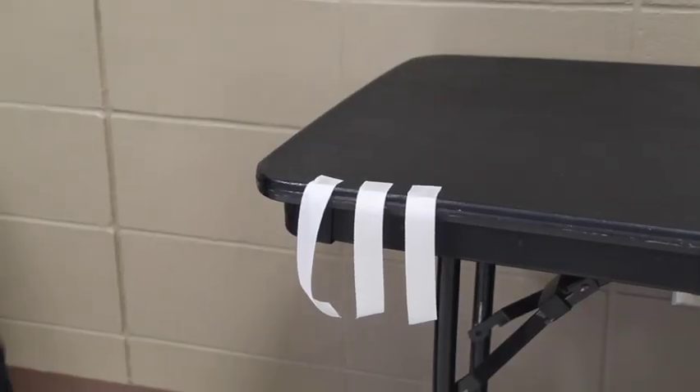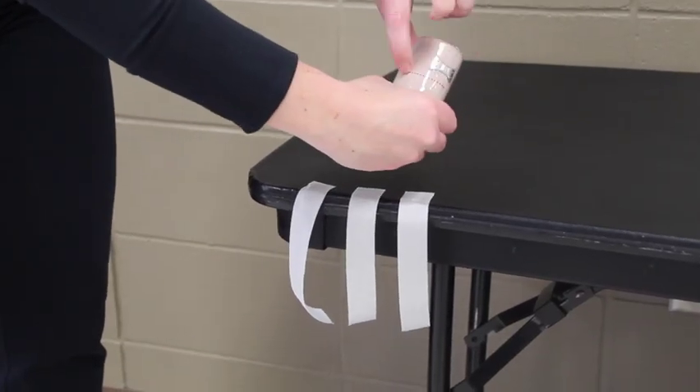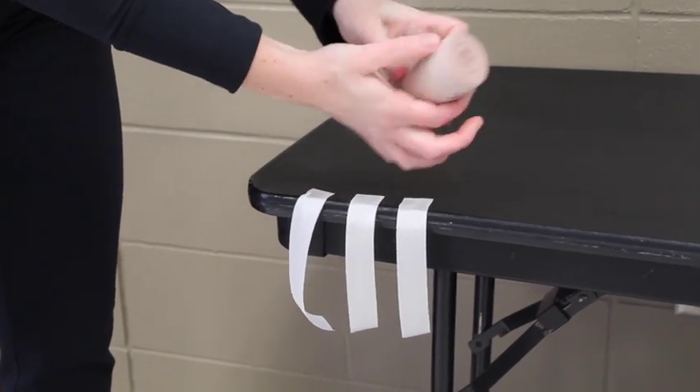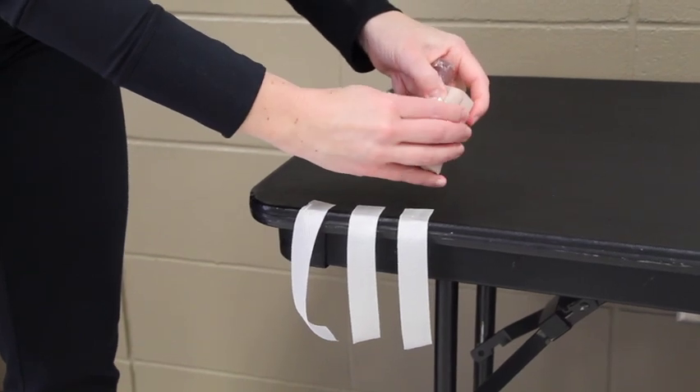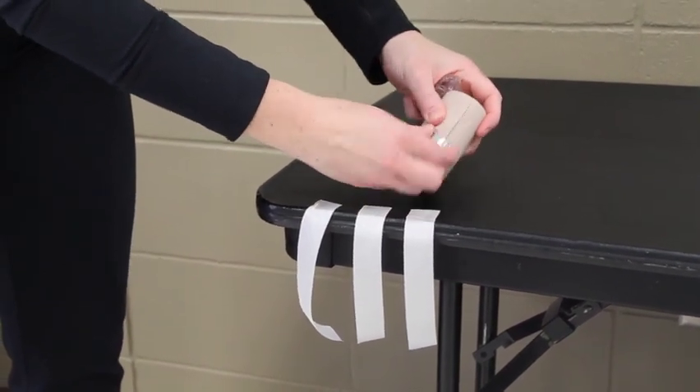Open the elastic bandage — some packages have a red dotted line in the middle; twist to open the plastic, it's much easier to take off. I recommend taking those sharp clips and throwing them in the garbage, as they tend to hurt people.